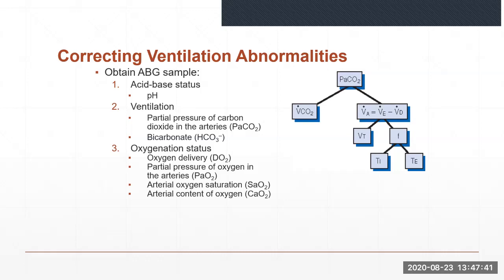The following discussion focuses on those factors that can alter PaCO2 during mechanical ventilation, including minute ventilation, physiological dead space, and CO2 production.